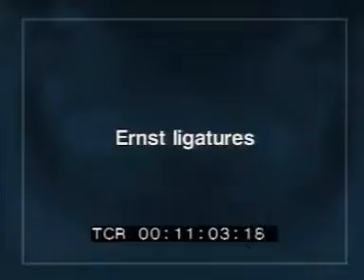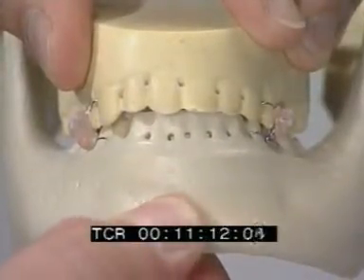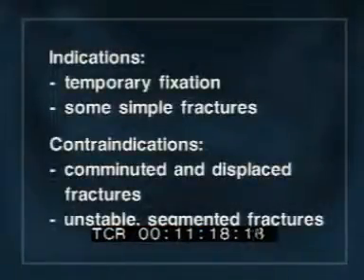Ernst ligatures are a common method of wire fixation, although it should be understood that using Ernst ligatures leads to reduced stability. The major indication for Ernst ligatures are temporary fixation until definitive operative treatment and some simple fractures. The contraindications are comminuted and displaced fractures and unstable segmented fractures.